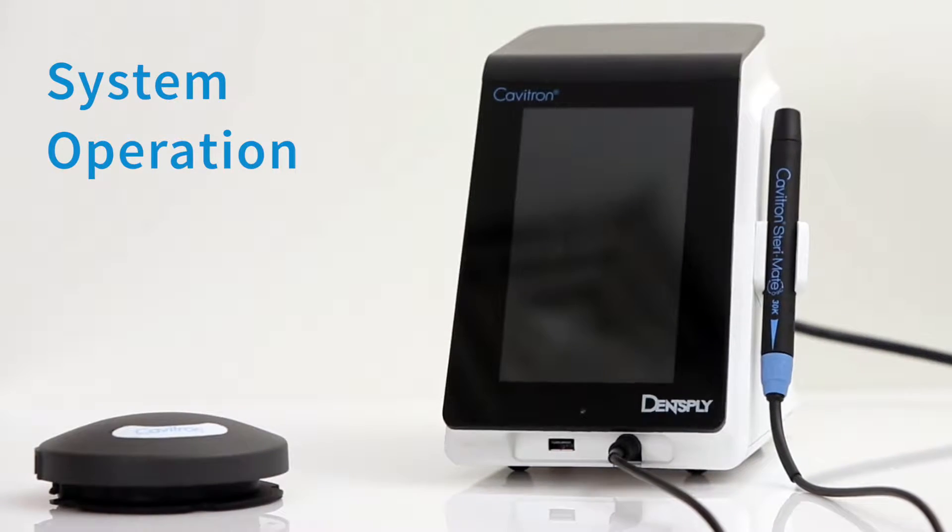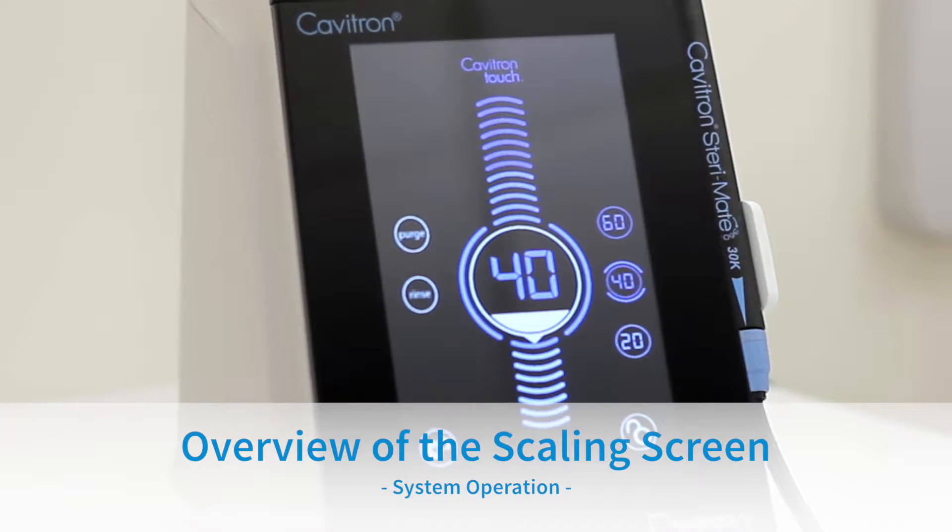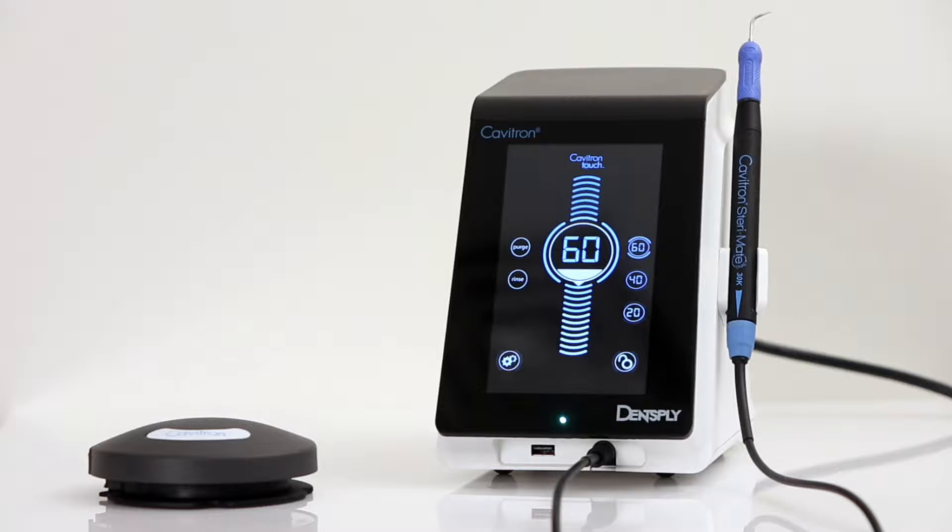System Operation: Overview of the Scaling Menu Screen. This is the scaling screen of the Cavitron Touch that will allow for adjustment of the operation. Please note that the touchscreen controls will either require a tap of the icon or a tap and hold for a full 2 seconds.